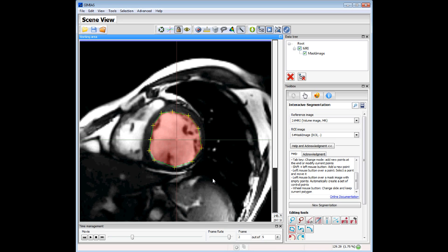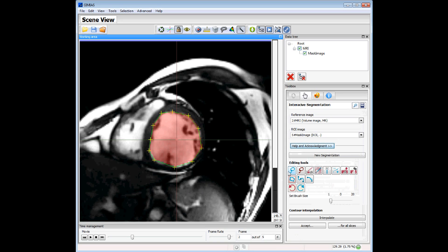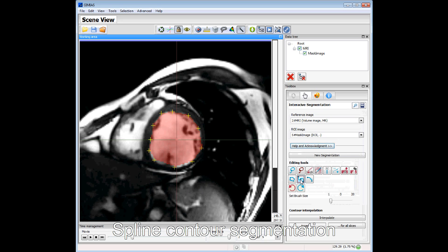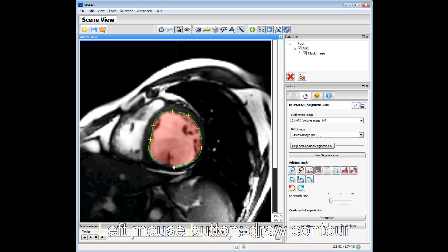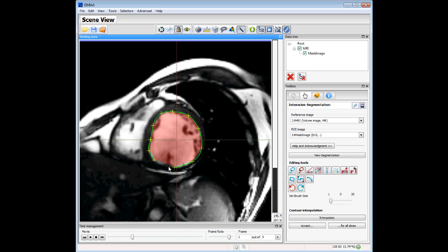These are the basic features of this contour segmentation. We can also use another kind of contour method, like the spline method. We choose the spline method, press the left mouse button over the image, and we can see the spline segmentation.